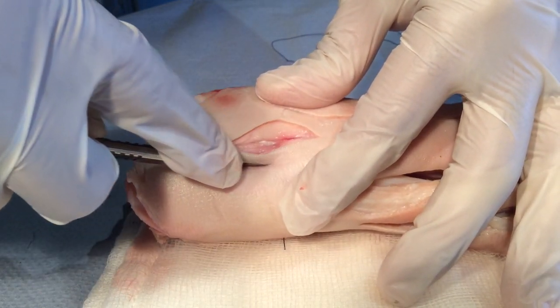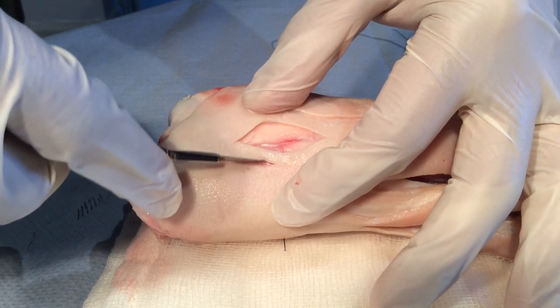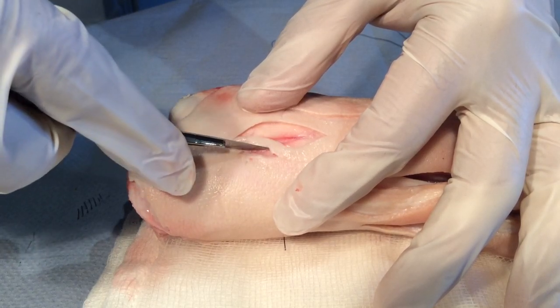In this clip, I have applied little pressure on the skin, barely going into the subcutaneous fat. You can see that the width of this wound is a lot narrower compared to the previous.